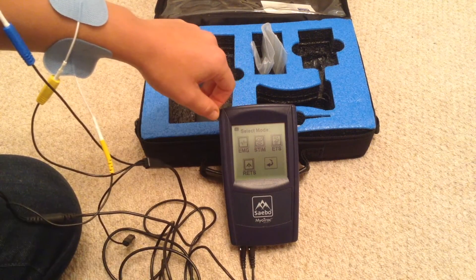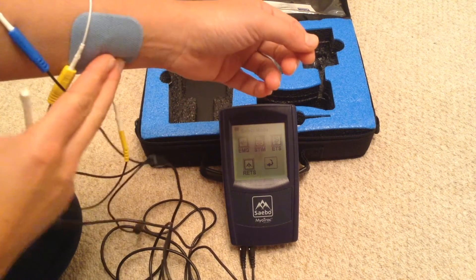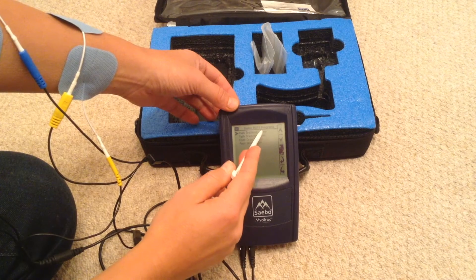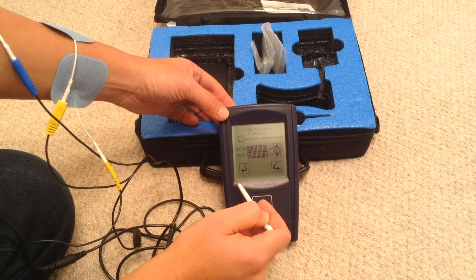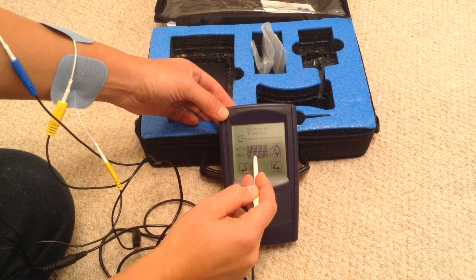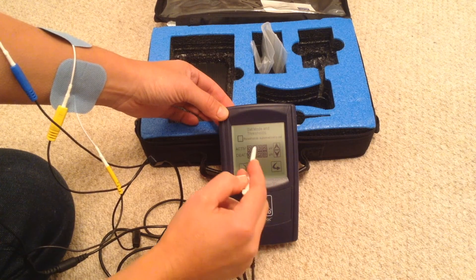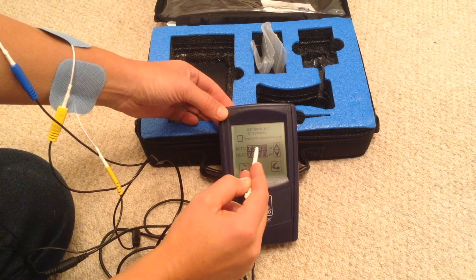Channel A is stimulation in the RETS program and B is for the biofeedback. So I'm going to click RETS, go into the program mode, go to task training slow, which is the most common that I would use clinically. Click the forward arrow. I've got an activation threshold of 32 at the moment and deactivation of 28. I can alter that here or during the program. They might not be strong enough to get over the activation threshold, in which case I decrease it.